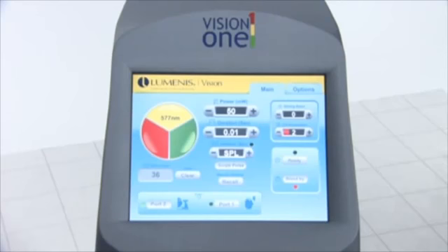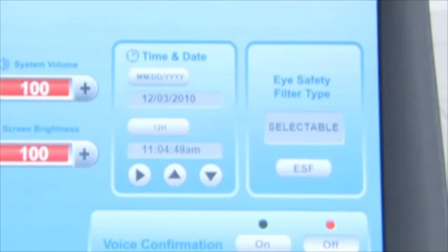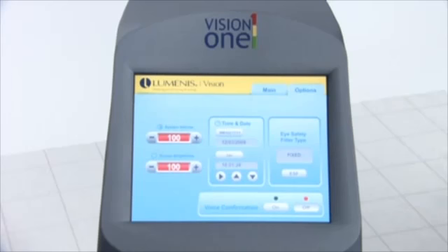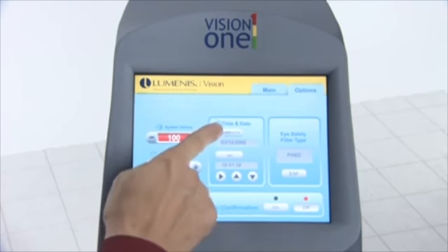To select the eye safety filter mode, press the Options tab to view the option screen. Next, press the ESF selector until the desired eye safety filter mode displays. Press the Main tab to return to the treatment screen. The laser has a real-time clock that maintains the current time and date across shutdowns. The time can be displayed in either 12-hour, AM or PM, or 24-hour format. The date is displayed in four user-selectable formats.